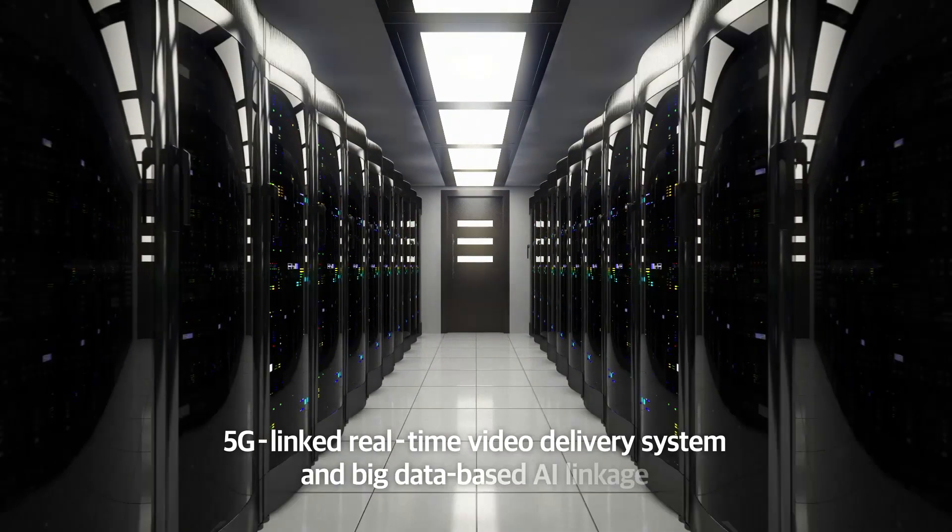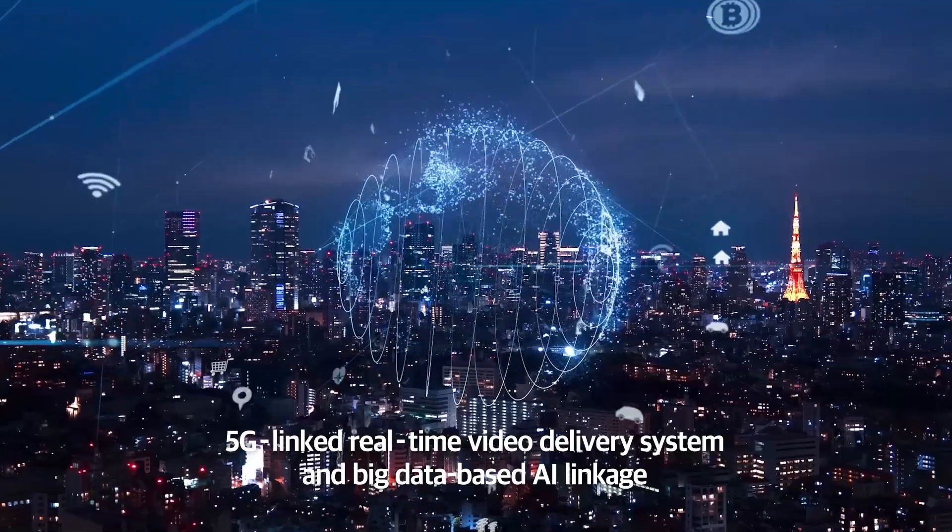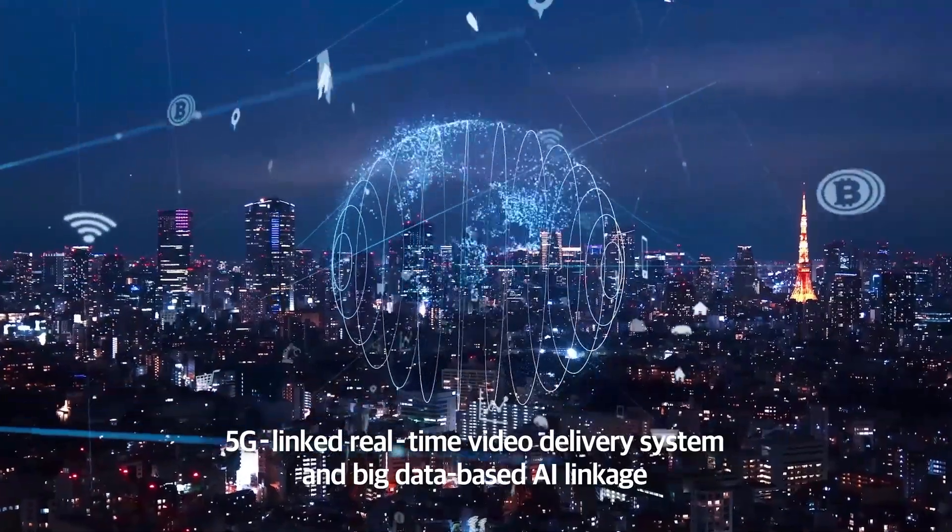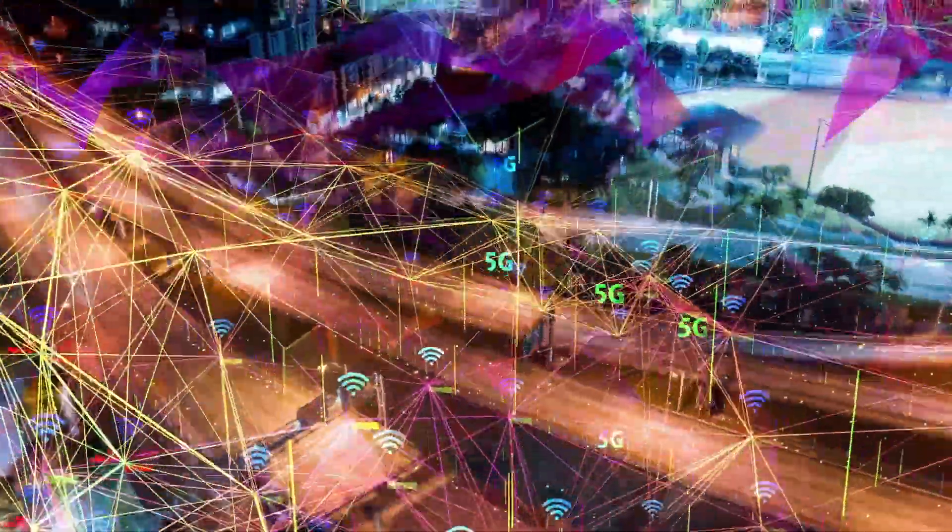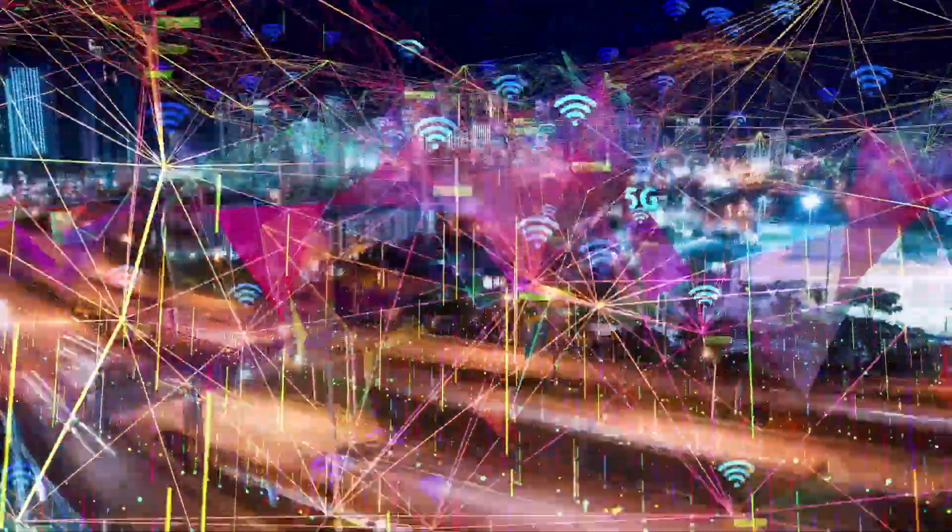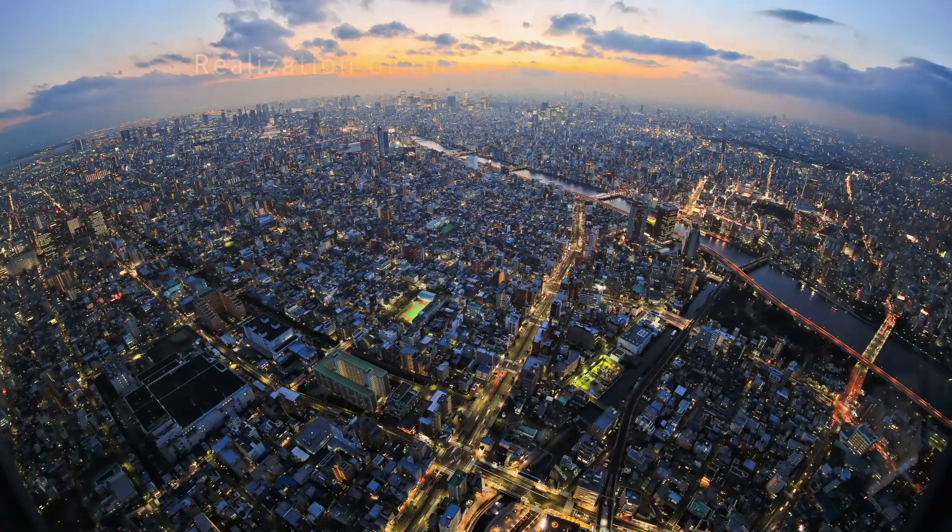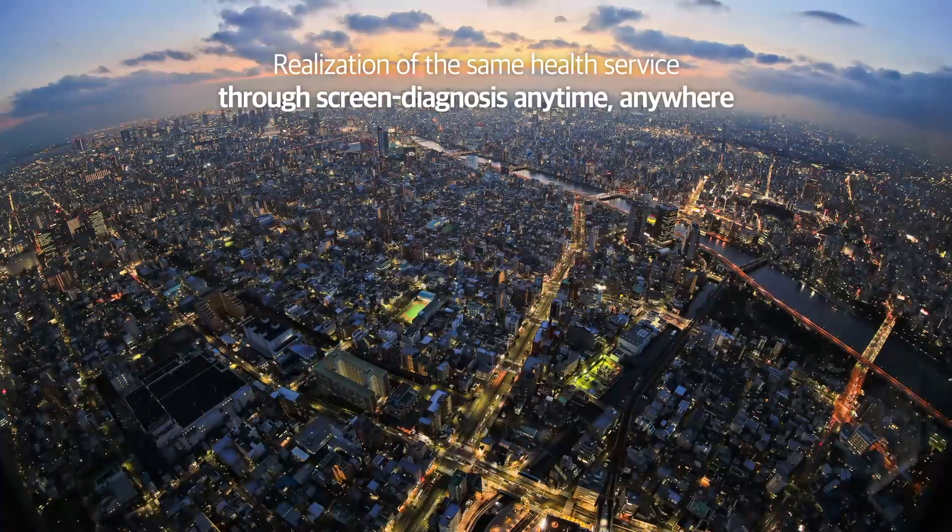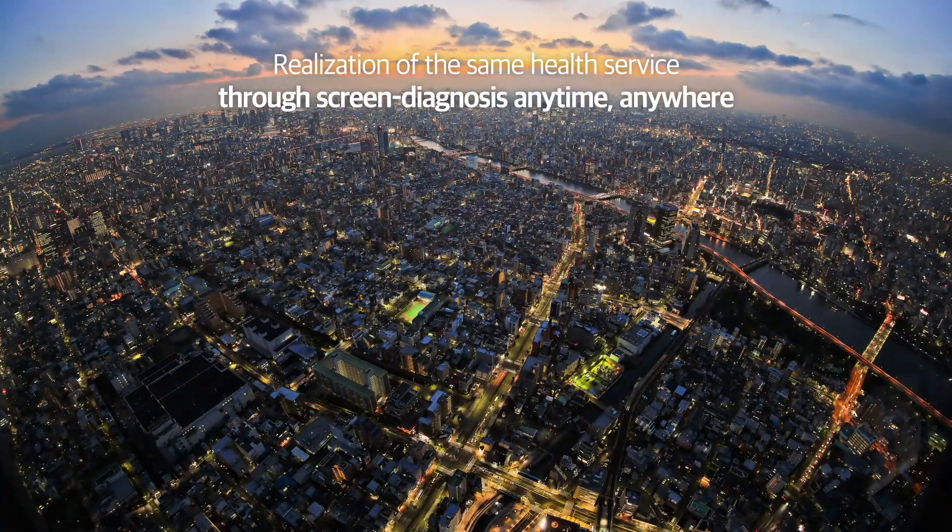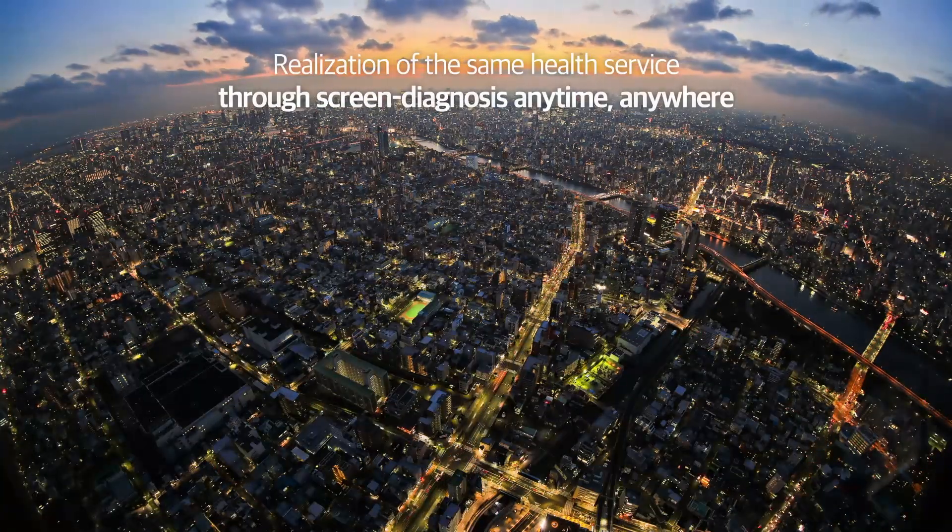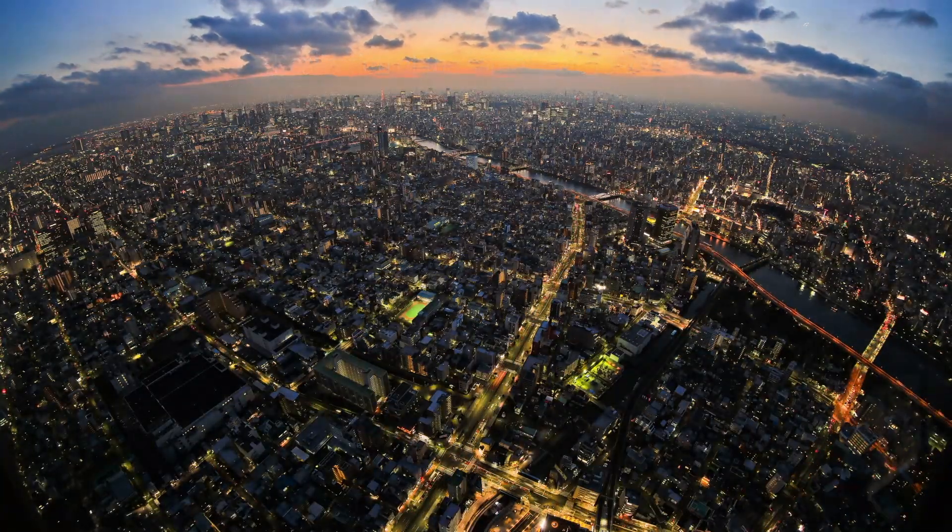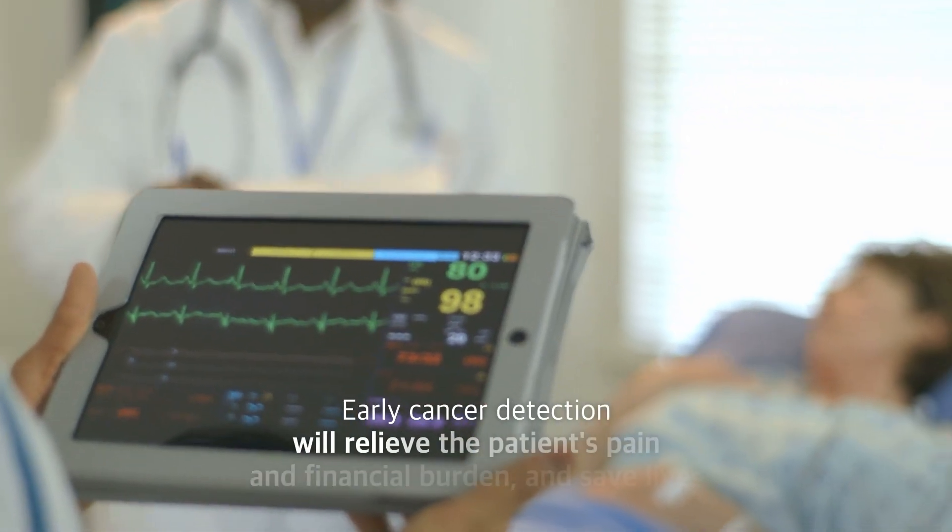By linking 5G connected real-time image delivery system with big data-based AI, it is capable of realizing the same health service in small local towns and wherever in the world through the screening diagnosis, which was accessible only in large hospitals.